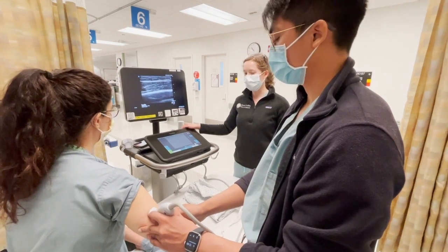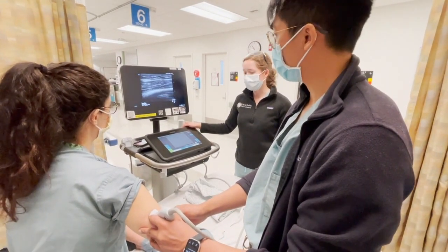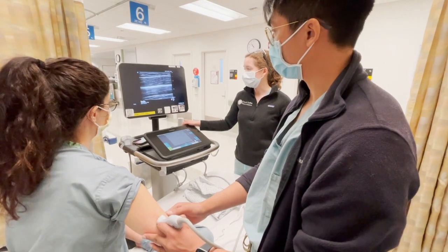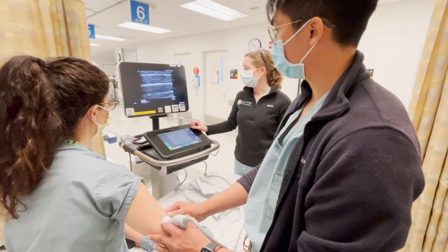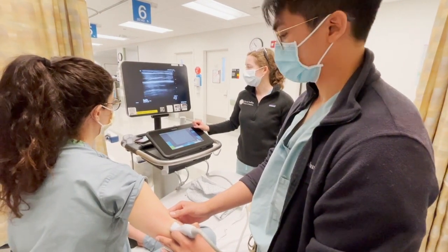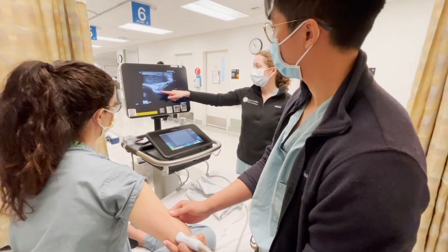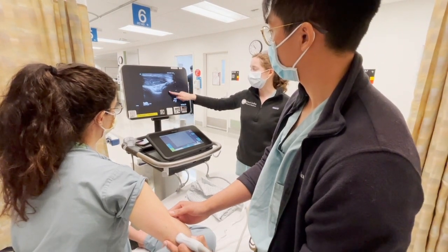We'll scan inferiorly down towards the elbow with the probe indicator pointing towards her shoulder, and we'll move down so we can see the elbow joint. You can see the triceps muscle will come together into a tendon as we get closer to the joint.